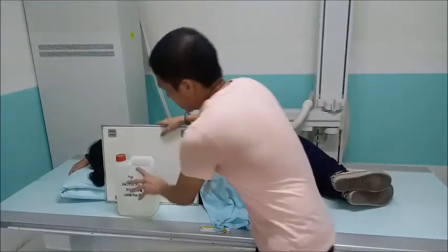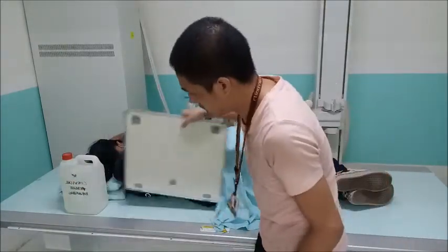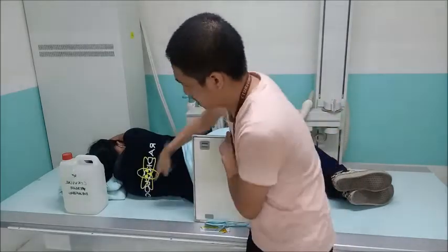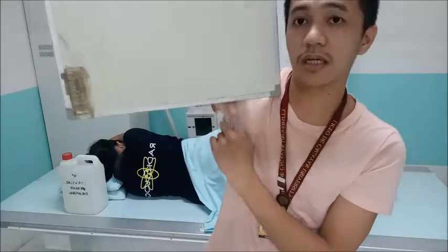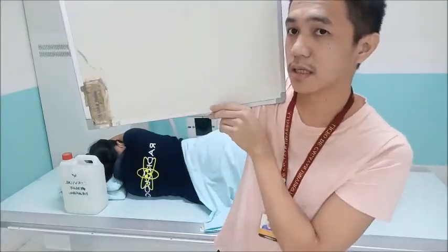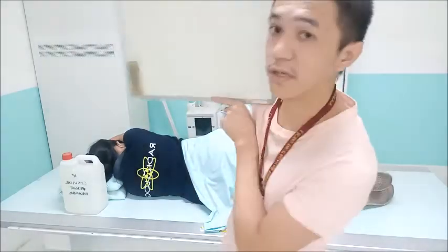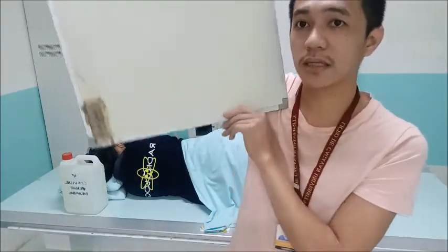Okay, so if there is no foam wedge between the table and the patient, the edge of the patient is against the table side. That means some of the structures will be cut off, so they will not be displayed on the radiograph.